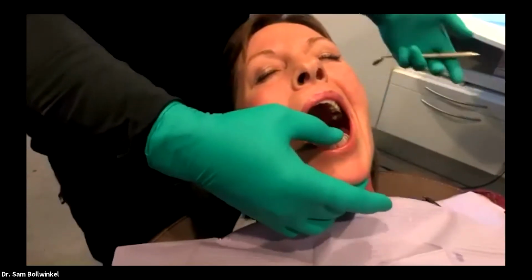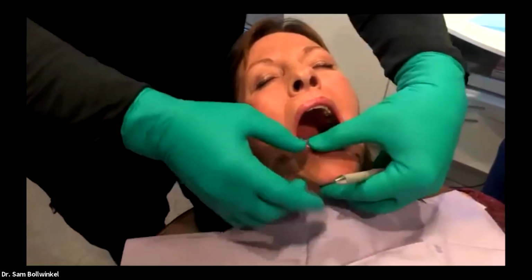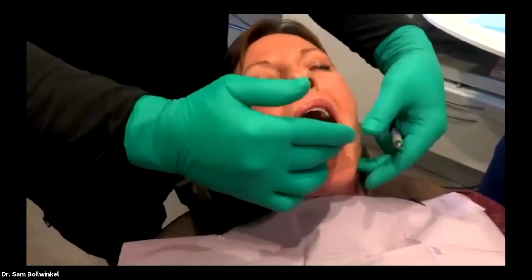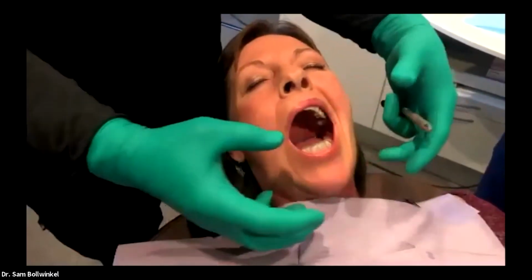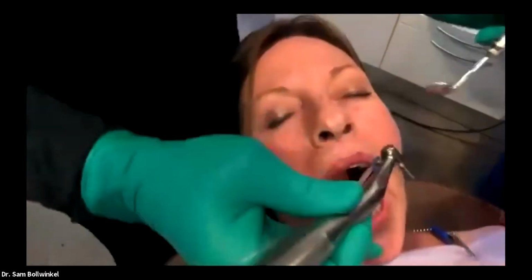So literally now with this type of a guide, I can hold it with one hand, my team can hold it with one hand, can retract, and we can do the work that we need to do. And I don't have to have 6 hands in here trying to help stabilize to make this happen. So we had an opportunity with our planning process to determine that with Carrie today, we can do just a tissue punch. So we do not have to flap. She's got plenty of attached tissue. So we're going to go through.